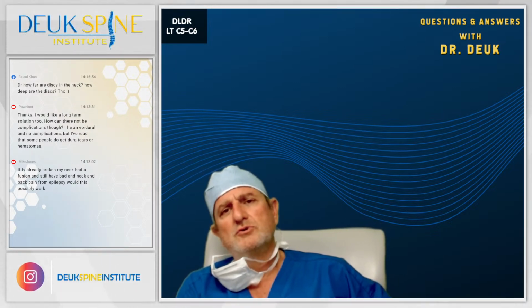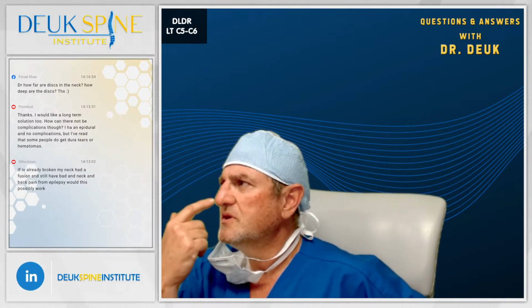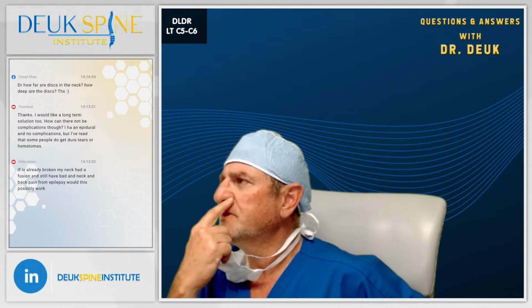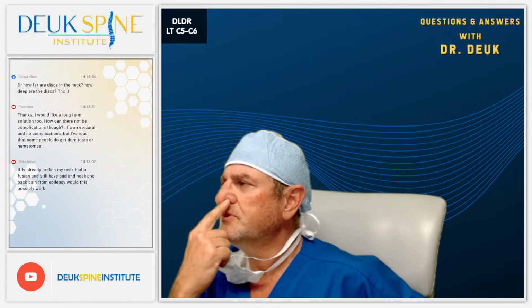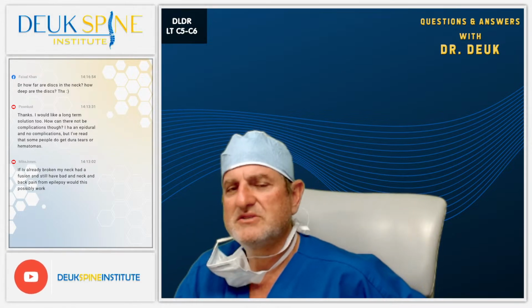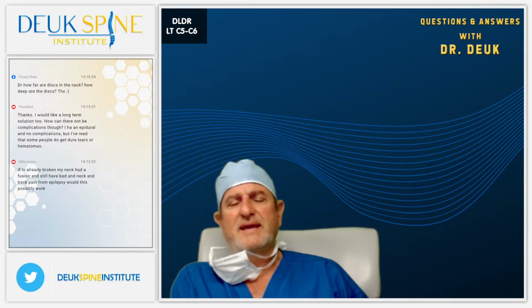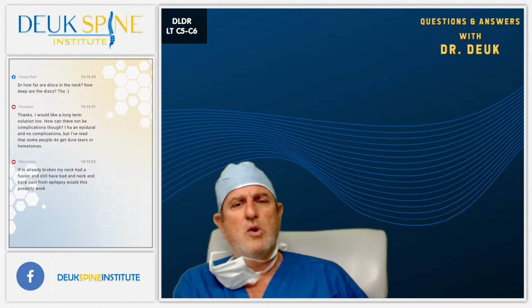If you were to take a picture of my nose here, and then another picture here, it would give you an average nose somewhere between the two. That's not my real nose. My real nose is what you see three-dimensionally. I can see three-dimensionally with much greater accuracy with the endoscope. We don't need an MRI.